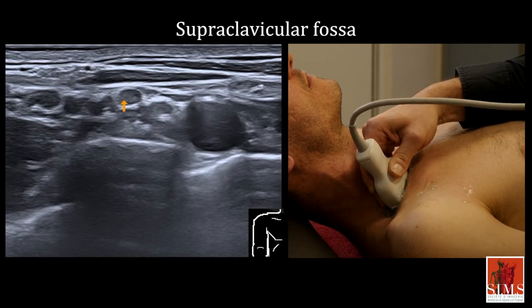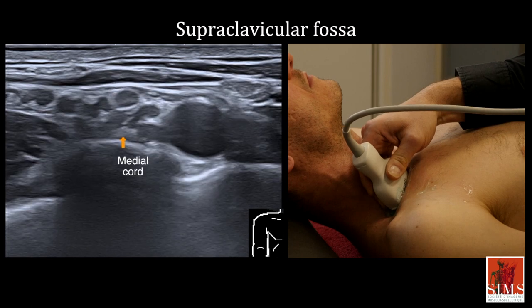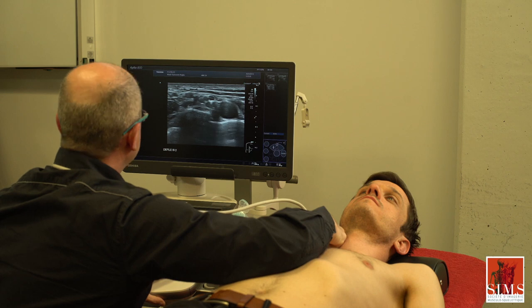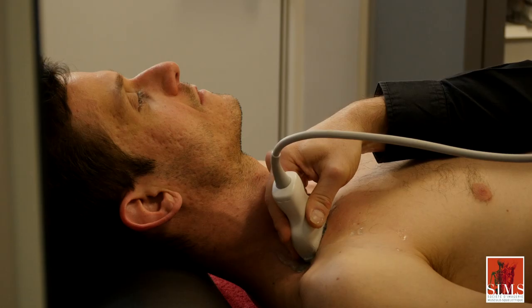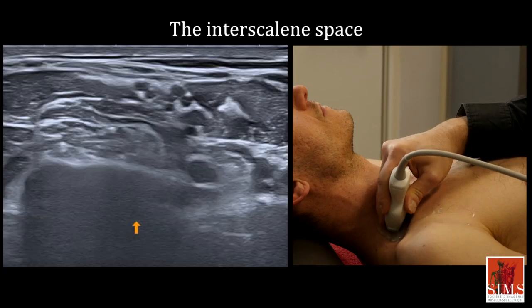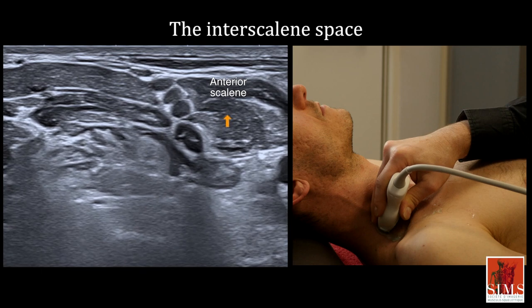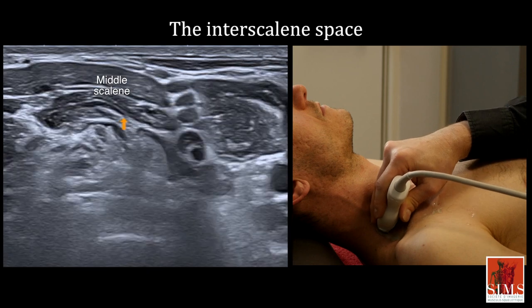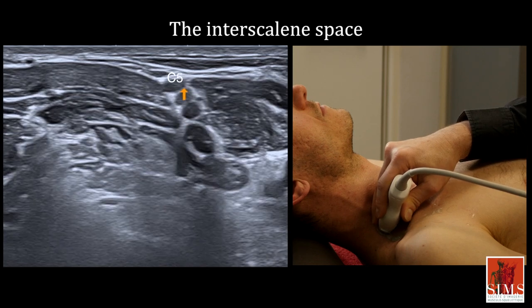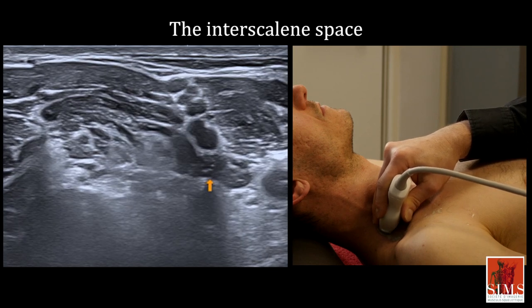The lateral cord is located rather anterior, the posterior cord is rather lateral at this level, and the medial cord is rather posterior. Starting from the reference view on the supraclavicular fossa, and using the ski lift technique, we can follow the nerve structures and quickly reach the interscalene space, consisting of the anterior scalene and the middle scalene. You see that the roots are arranged in this space from superficial to deep. C5 is the most superficial, while C6, C7, C8, and T1 are harder to see deeper down.